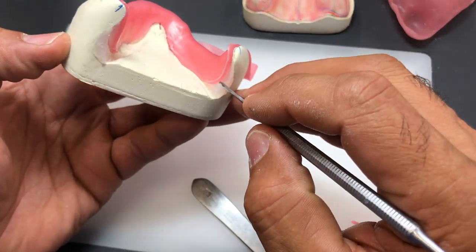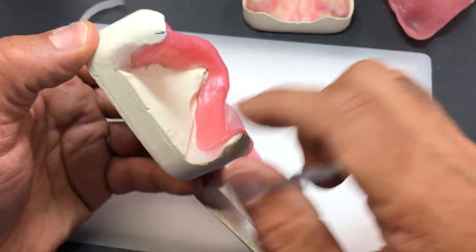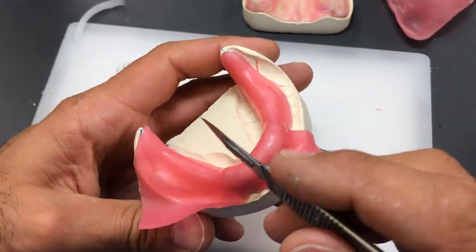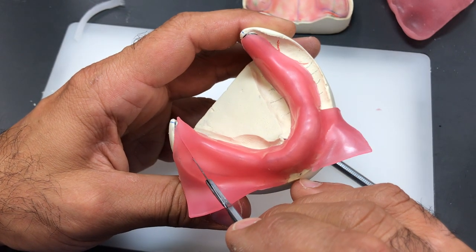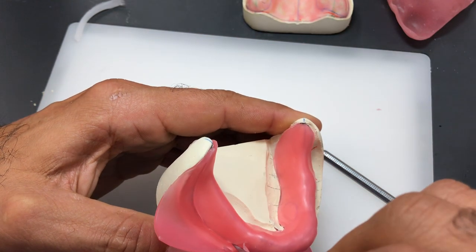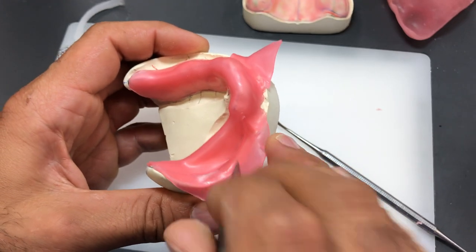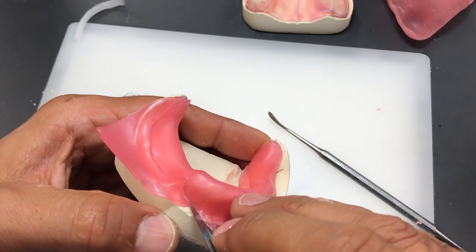Some of the utility wax, you might have to go back and clean it off here, but the important thing here is that we get a nice sharp ledge from our cuts. So rotate your cast so that you can see that line and follow that line as much as you can, so we don't change the length of this tray.